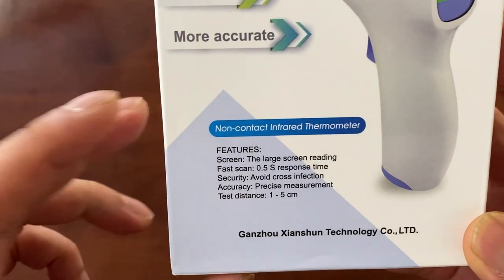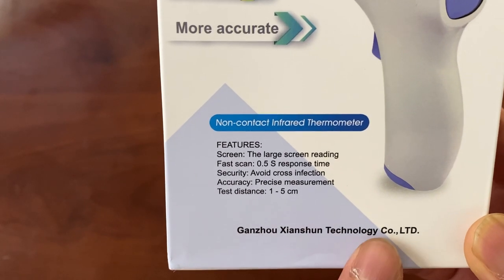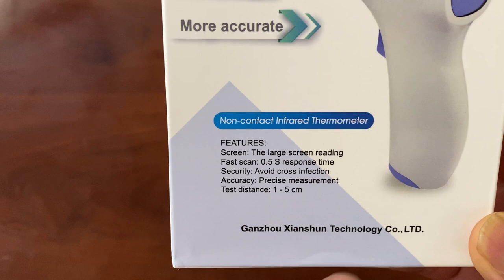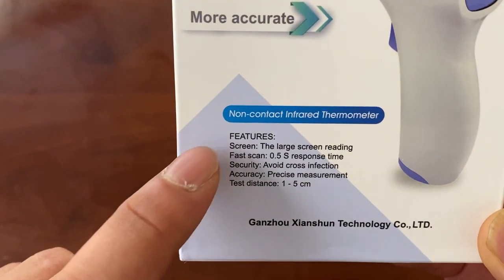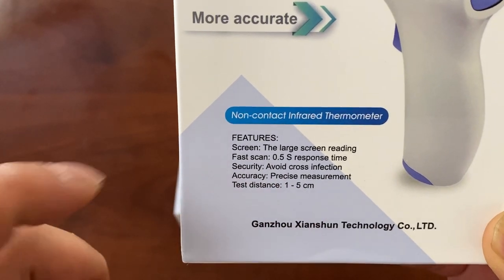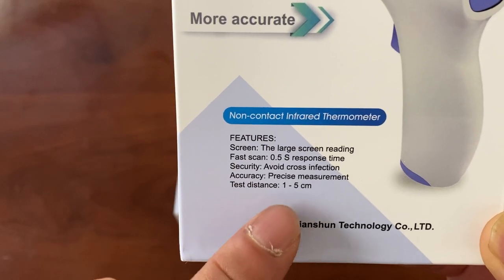You can read the features here. You can see this is made in China — most things are made in China nowadays, so that shouldn't really matter. It has screen reading, fast scans, advanced security to avoid cross infection, accuracy, and a test distance of 1 to 5 centimeters.